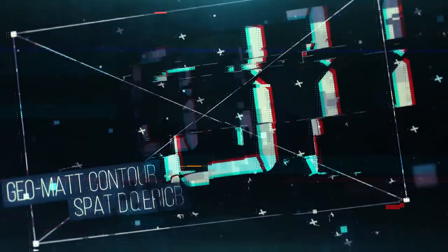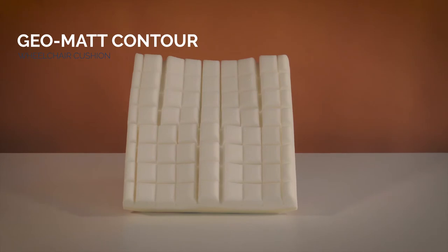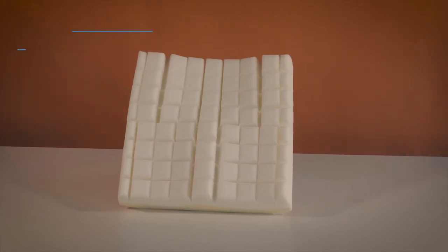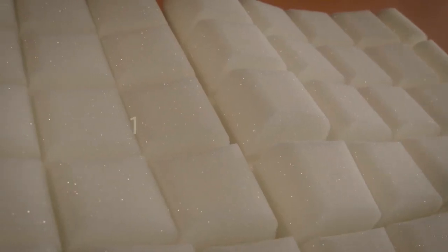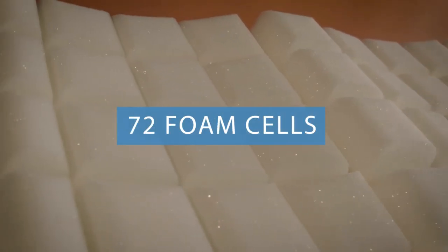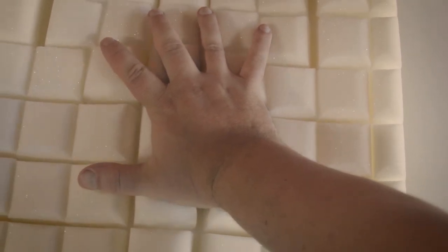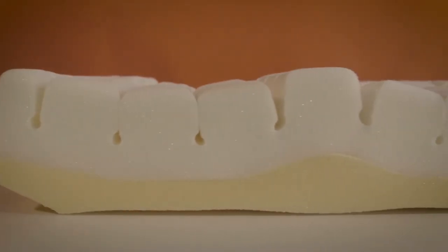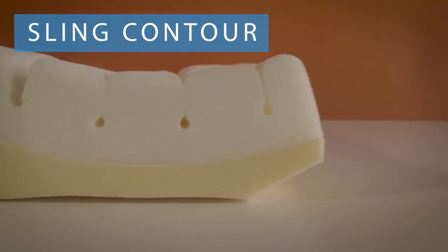Our pick for the best wheelchair cushion in the foam category goes to the Geo-Matt Contour Wheelchair Cushion from Span America, with its every detail designed to maximize pressure reduction and skin protection. Composed of 72 independently moving supportive foam cells, the Geo-Matt Contour conforms to your every move, while the high-density contoured foam base is lightly curved on the bottom to prevent sagging in sling wheelchairs.